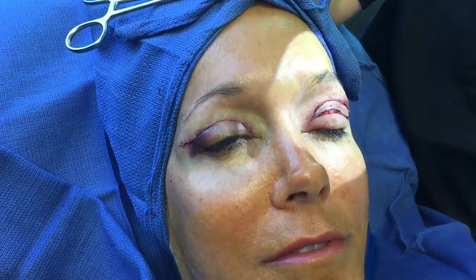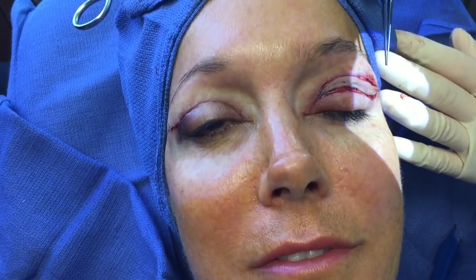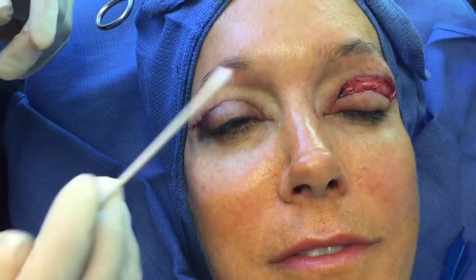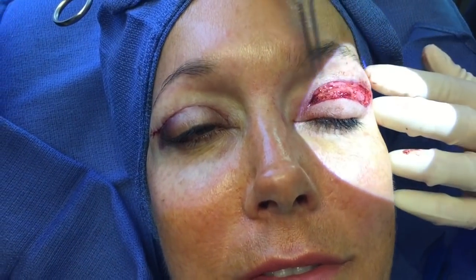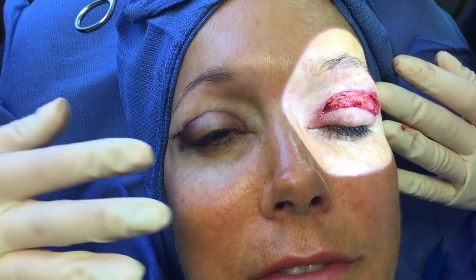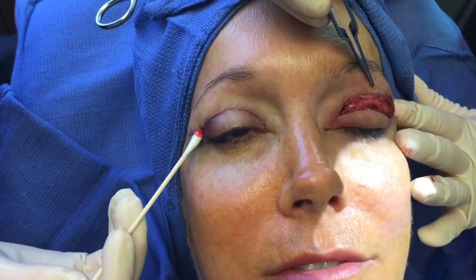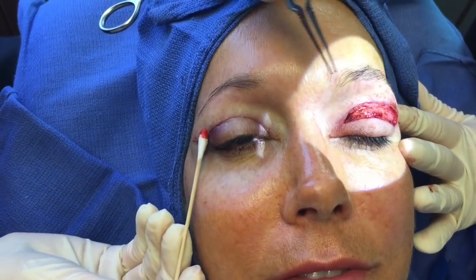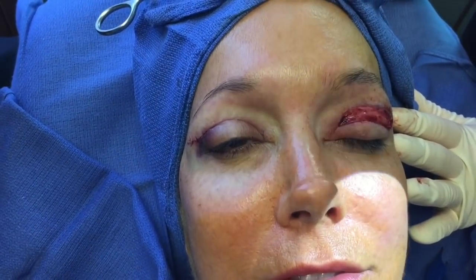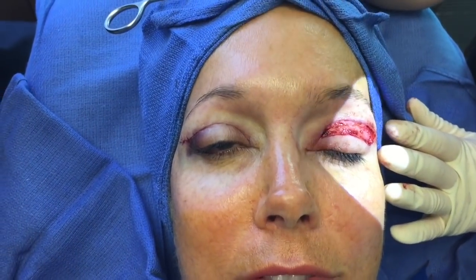The procedure has been virtually painless — she doesn't feel a thing after the injection. You can see from this side the skin is ready to be removed; the skin comes off exposing the muscle underneath, and we're almost ready to close the incision and the surgery is pretty much complete. This will heal in around a week — sometimes five to six days — and I'll take out the sutures and she'll be ready to go back to work. It's very common to see a little eye opening as you see on this side; that'll close up shortly after surgery due to some swelling and the local anesthetic injected at the beginning.